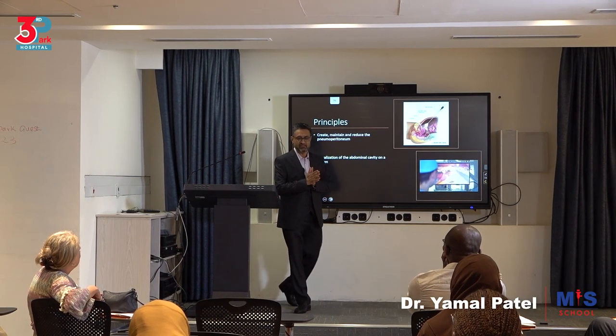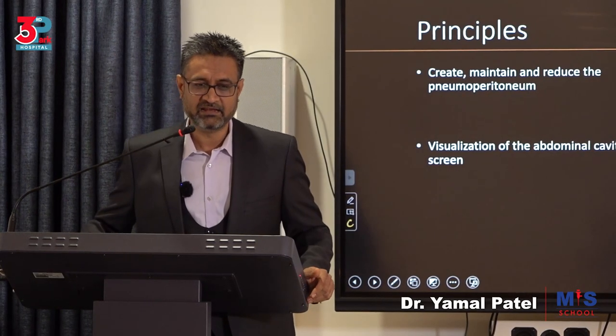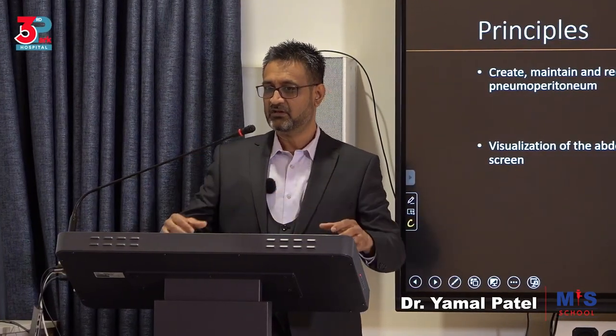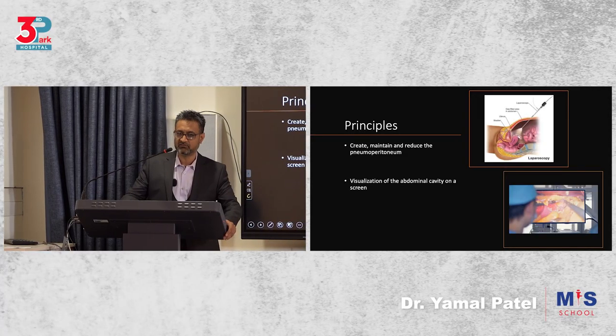A few principles I believe are very important to mention. Number one, we have to know that laparoscopy means we work within a cavity, which in this case is the abdominal cavity, or the uterine cavity in hysteroscopy, but you have to create this cavity because the normal cavity of the abdomen is actually a vacuum, it's negative pressure. So you have to distend this cavity with a pneumoperitoneum. That is a principle you have to remember, and we'll have to know very well how to do this safely.